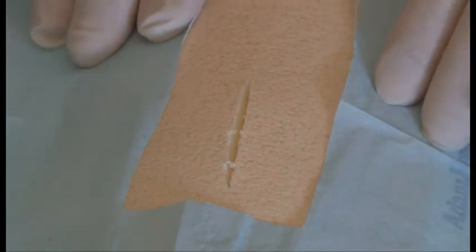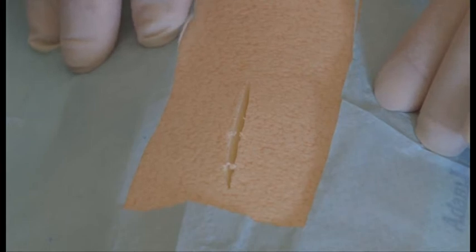We're going to demonstrate some basic suturing on this model, and to start with, we're going to demonstrate infiltration of the wound.